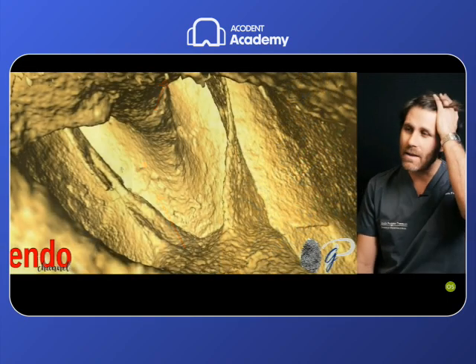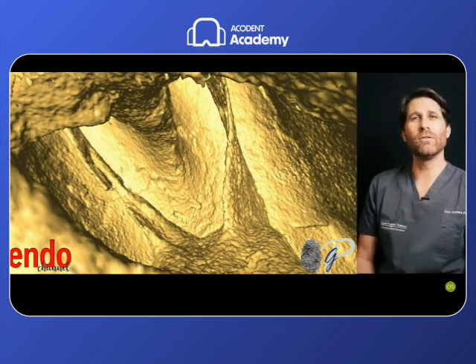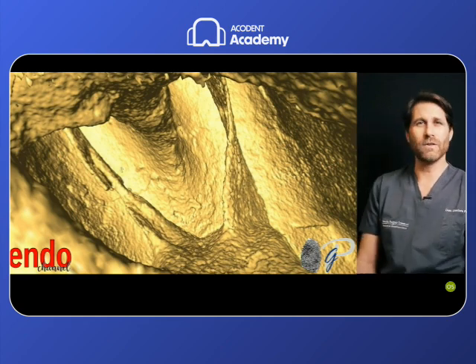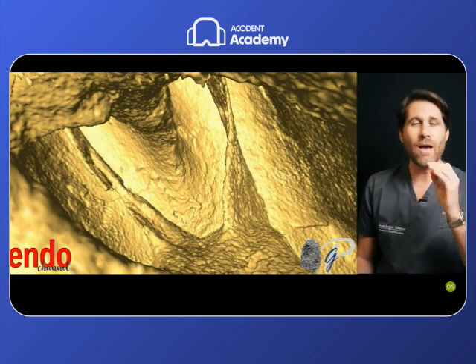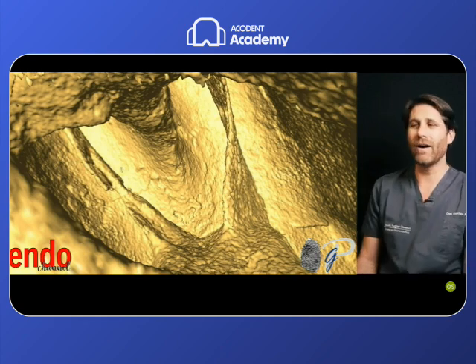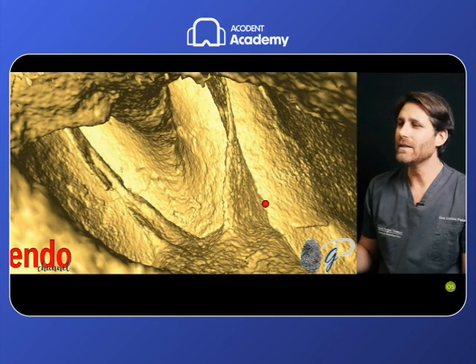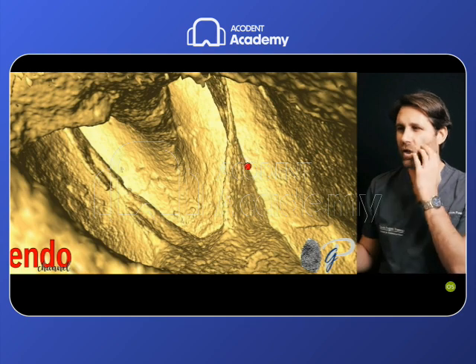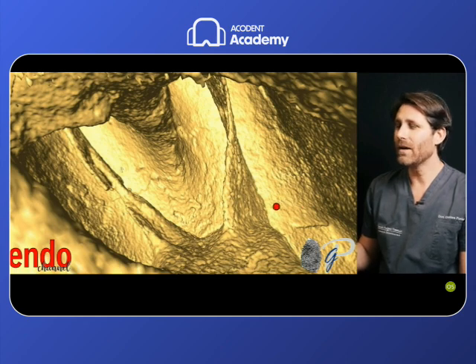And we are speaking about the moment in which we have an invitation, not the moment in which we are looking for the orifice. So after the orifice location, after we have identified the orifice and we see a space that starts to be penetrable to our hand files, and we start the scouting with our hand file, this is the MB1, this is the MB2 root canal with a big connection, big isthmuses inside the two root canals, but you can see the MB1 root canal is moved more mesially.